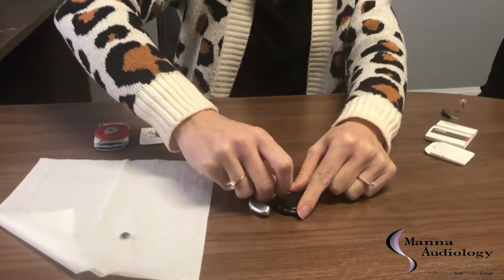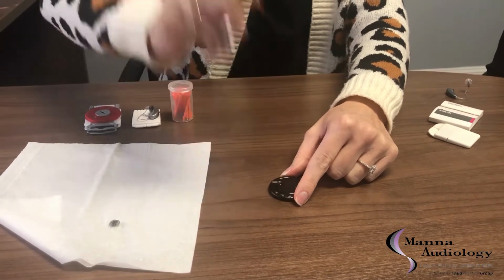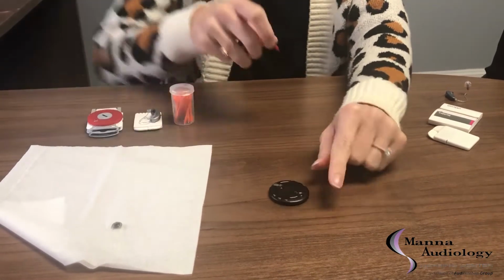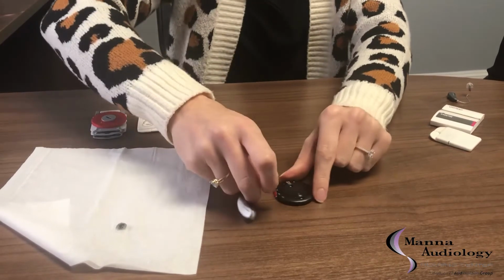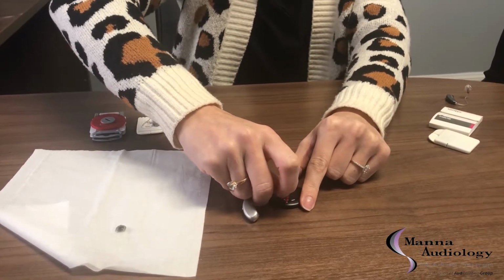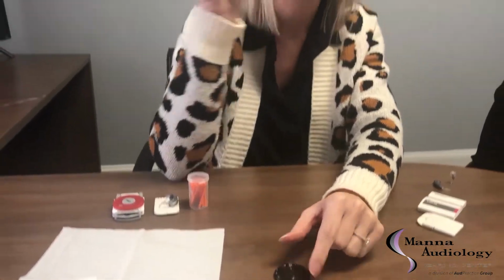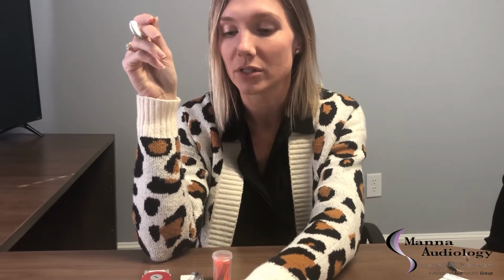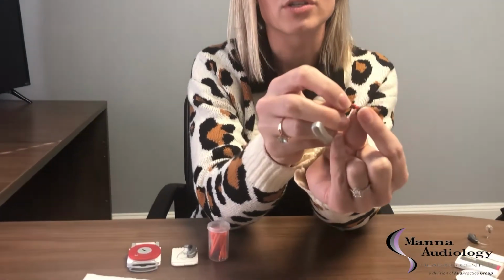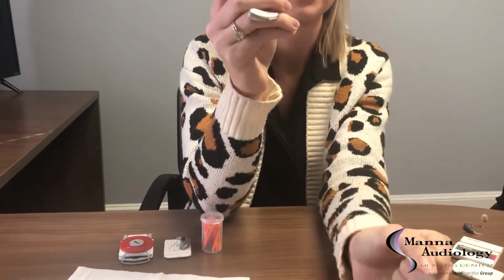And you're going to push it straight down until you hear or feel a click, and you pull it out. And then you're gonna go to the number 2 slot and put in the new wax trap. Same thing, straight down, wait for that click, and now you have a new one. And very similar to the Oticon again, with the dome, it just goes right back on there, and you wanna make sure it's on there nice and secure.